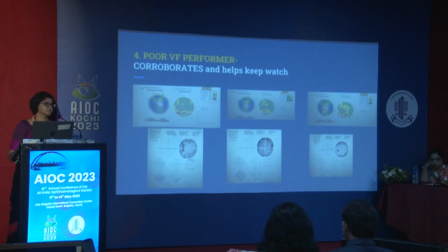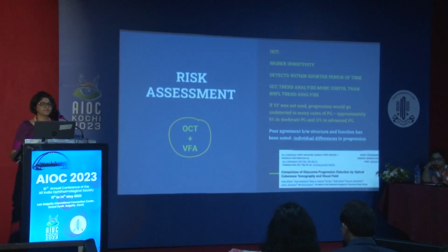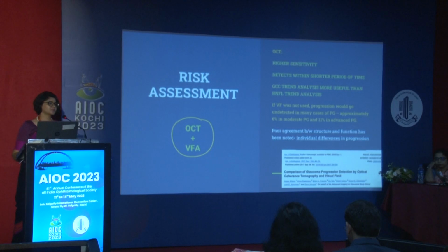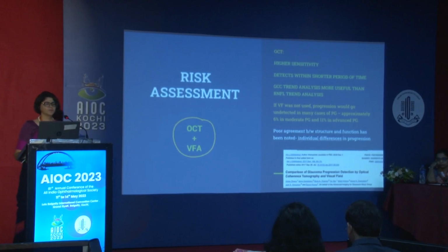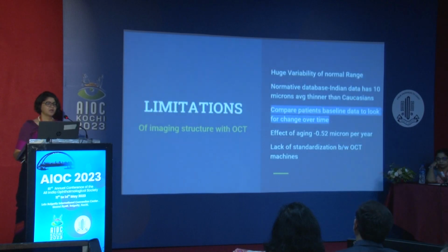OCT in general is useful to give us additional information in poor visual field performers. OCT and VFA taken together, of course, give us the best idea of risk assessment. However, the OCT has higher sensitivity, detects within a shorter period of time, and the GCC trend analysis was more useful than the RNFL trend analysis in this study. However, there are individual variations, so you have to keep that in mind.